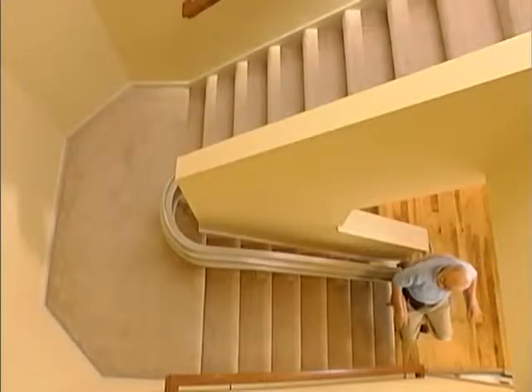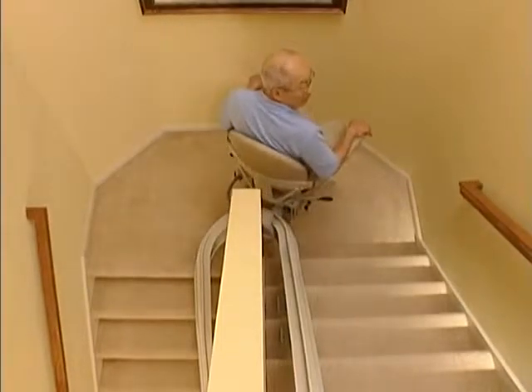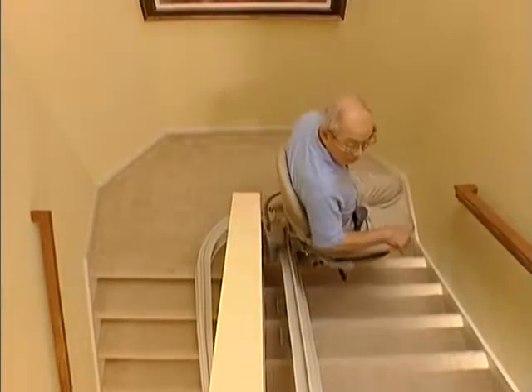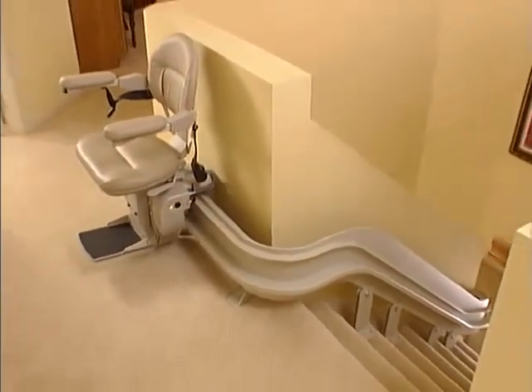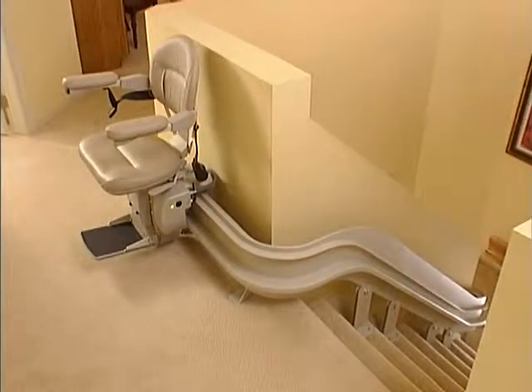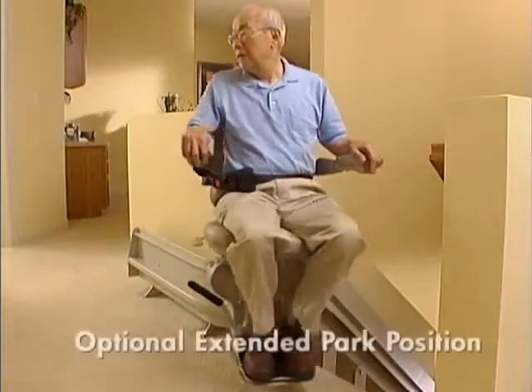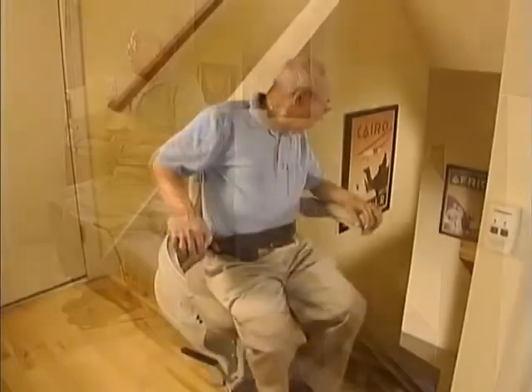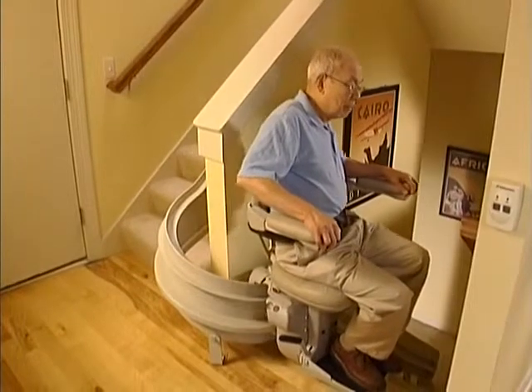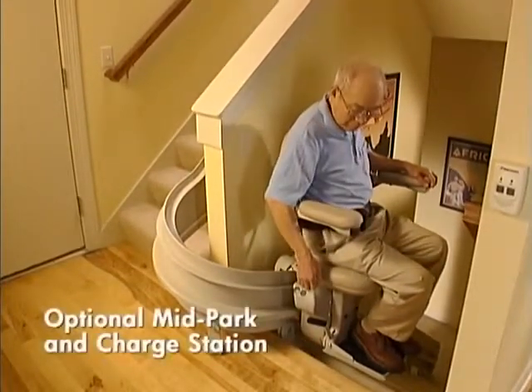The Elite Curve is a marvelous product, not only because it allows you to master your curved staircase again — no matter the size and number of turns — but because it allows you to customize its operation with those options that are important to you. Many people prefer to have the unit's carriage and chair completely off the stairway when not in use. For them, Bruno provides the option of an extended park position at the top and/or bottom of the staircase. In addition, for those staircases which have a landing between top and bottom, the Elite Curve offers an optional mid-park and charge station.